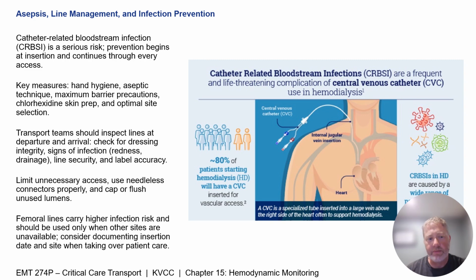In transport, it's especially important because the vibration, the movement, the environmental constraints all increase the chance of contamination or accidental dislodgement. Hemodynamic lines should be viewed not only as a monitoring tool, but also as a potential source of significant harm if it's not managed carefully.